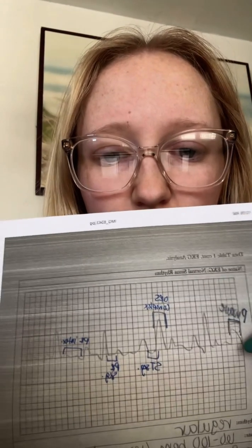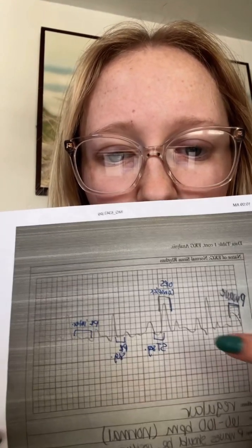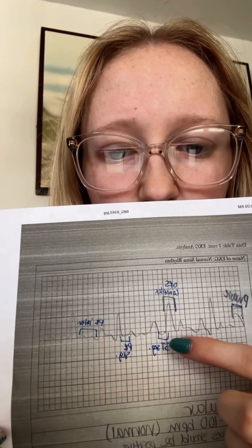Okay, so next we're going to be going over the different EKGs. This one is a normal sinus rhythm. That's what it looks like. Here's the P wave, the QRS complex, ST segment, PR segment, and the PR interval. The rhythm is regular. The rate is 60 to 100 beats per minute, which is normal. And the P waves should be going in a positive direction.